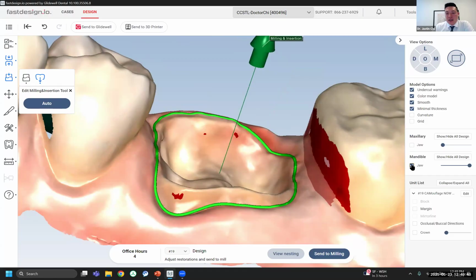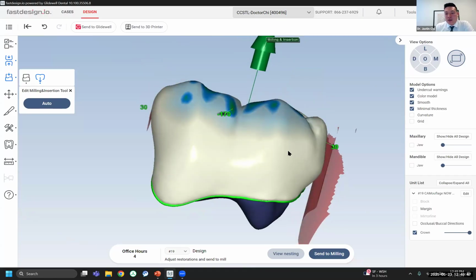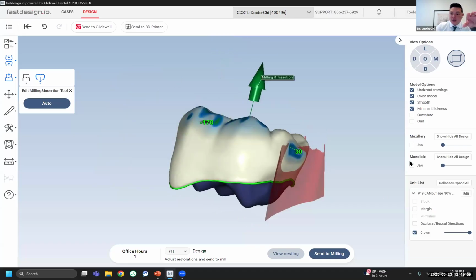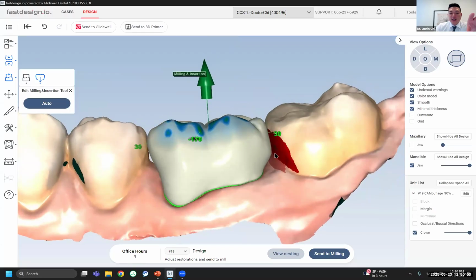And so when the undercut is really large over the adjacent teeth, what can happen is if your design goes within that undercut, it's going to be a little bit more work to get that to seat. The risk of having to adjust that contact is there just because the path of insertion, in this case, we're telling it more of a mesial inclination. So that undercut is potentially going to affect how smooth that restoration can seat into position. I hope that wasn't confusing.